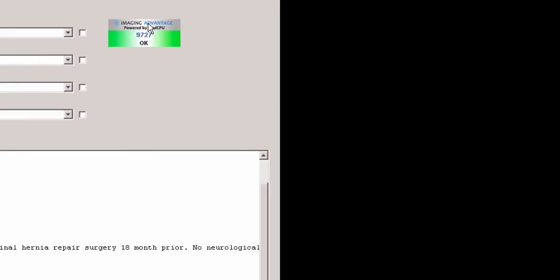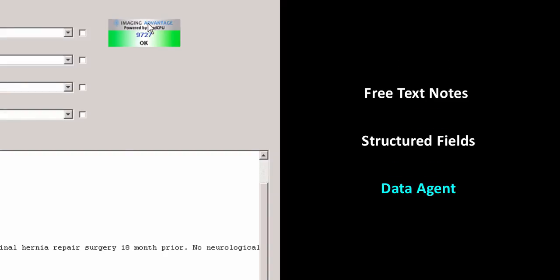And yes, for its accurate performance, beyond just collecting information entered into the EMR's structured fields, the advisor also reads the free text notes that are entered by physicians and nurses to the EMR and notes dictated to the organization's dictation system. The advisor's capability to read free text notes as well as structured data makes it a very accurate data agent that collects all patient information, regardless of where it's entered and in what format, structured or unstructured, making it an effective tool that keeps a comprehensive snapshot of the patient's data at any given moment.